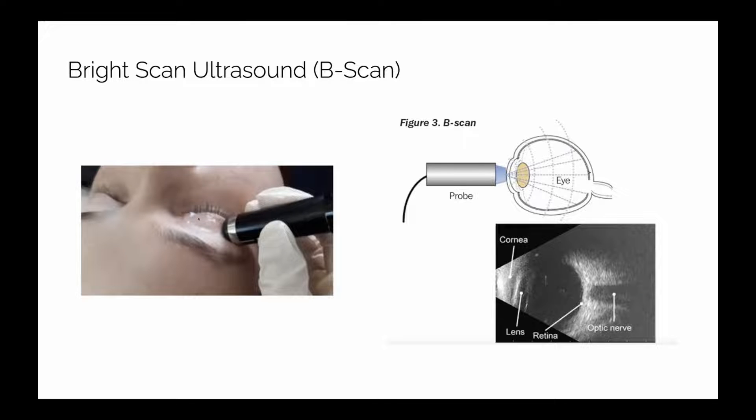You have a similar concept: a little bit of gel over a closed eye, and you'll get similar looking appearances. You can see the vitreous, the retina, and the optic nerve. That's a really good optic nerve right there.